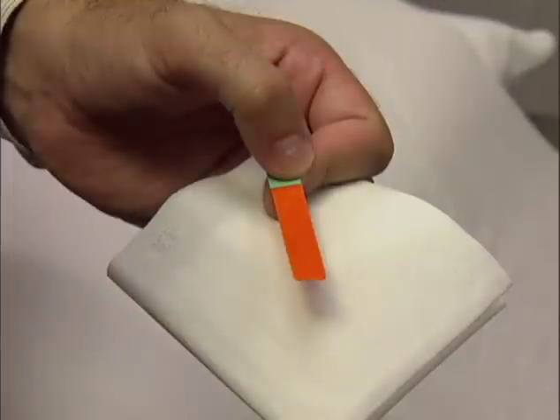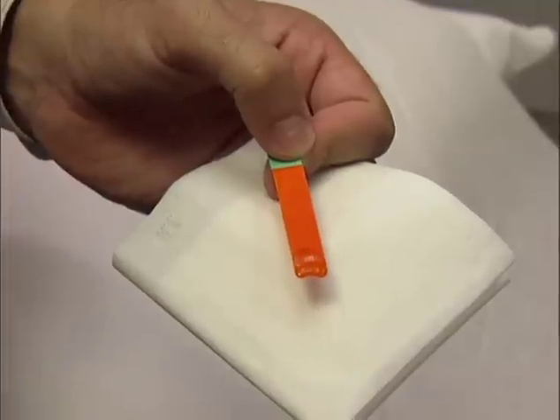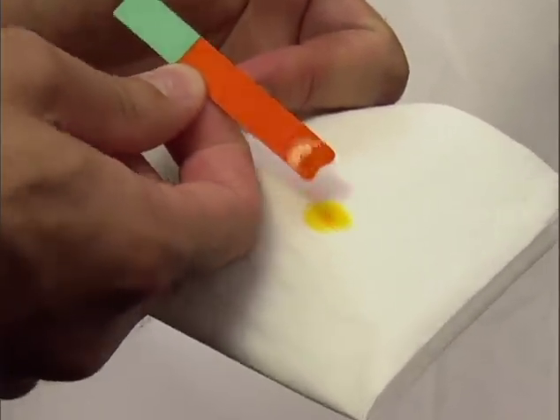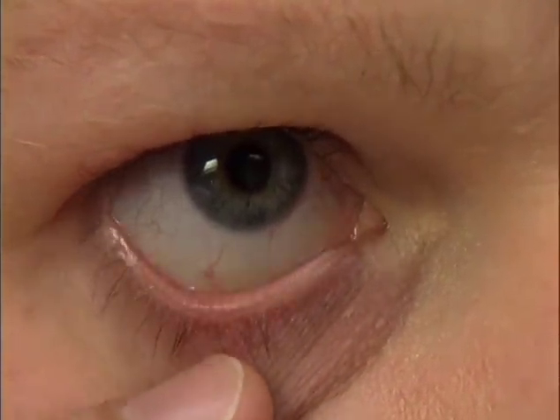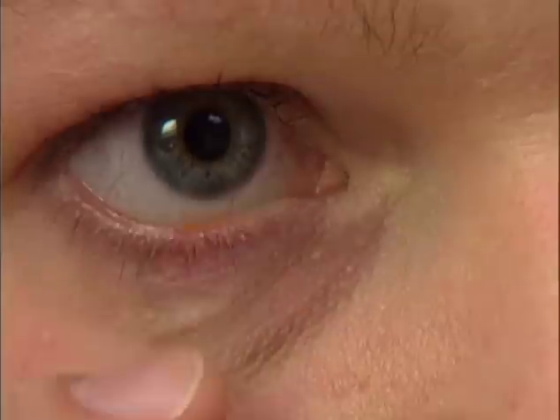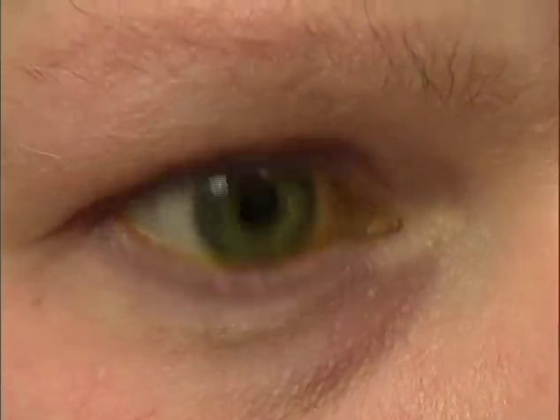To place fluorescein dye in an eye, take a sterile fluorescein-impregnated paper strip and dampen the end with a single drop of topical anesthetic. Carefully blot the excess dye and avoid getting it on any clothing, as it can leave a permanent stain. Ask the patient to look up and pull the lower eyelid down to expose the conjunctiva. Dab the wet fluorescein strip against the inner surface of the eyelid and then ask the patient to blink.